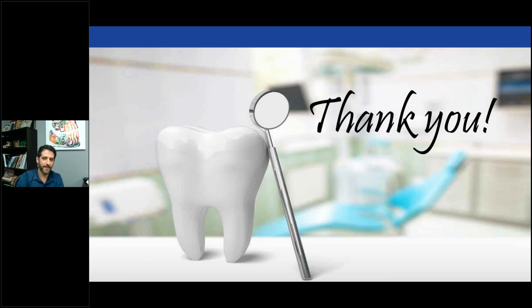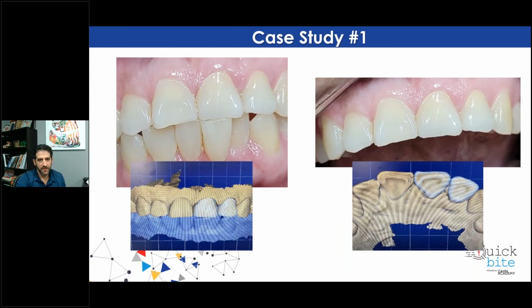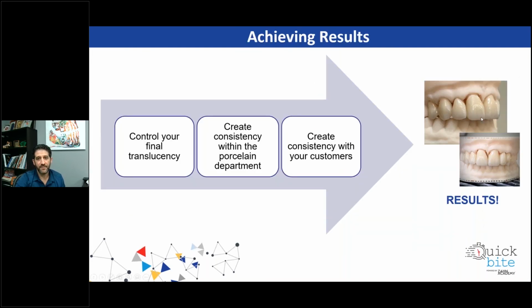Okay, and we have one more question. Is there a lot of post-characterization with Transitions? Only when you want to go to the high translucency. So as you saw on this case here, yeah, we did a lot of characterization because it's a high aesthetic case. We're going to charge a lot of money for it. We sintered it to have high translucency on it. And that's when our lab slip says high translucency, our ceramists need to give it more characterization to achieve that translucency. But if you're just going for a solid zirconia basic crown, that's probably your lowest charged crown.